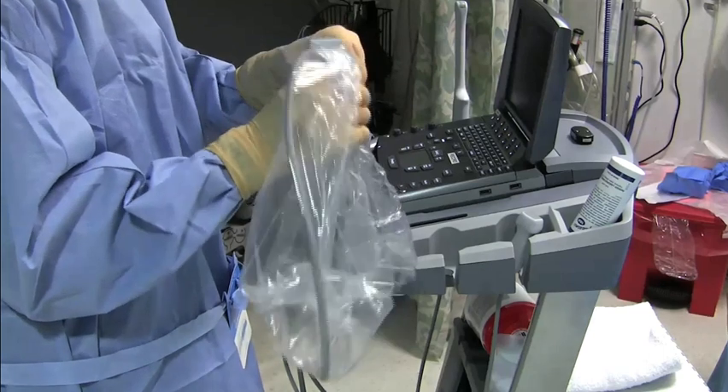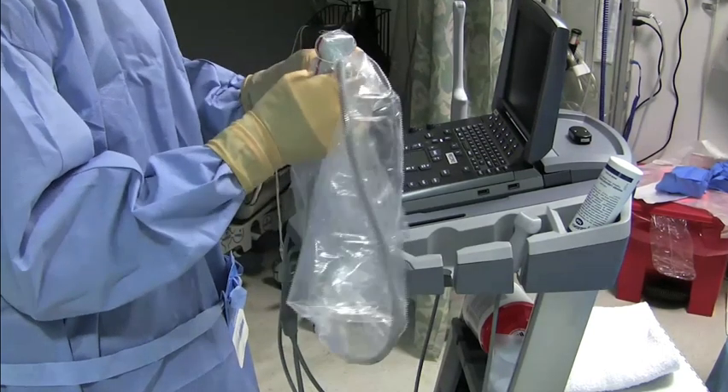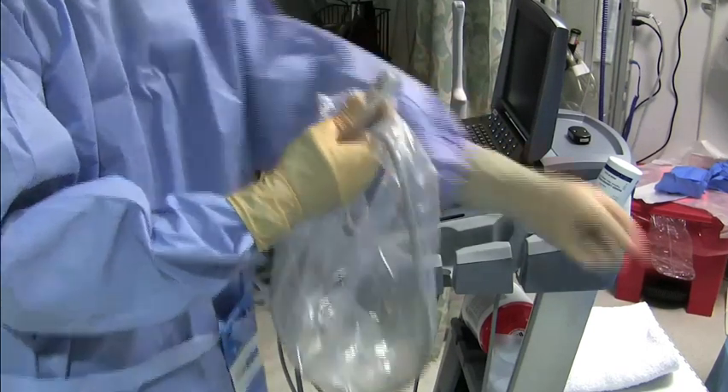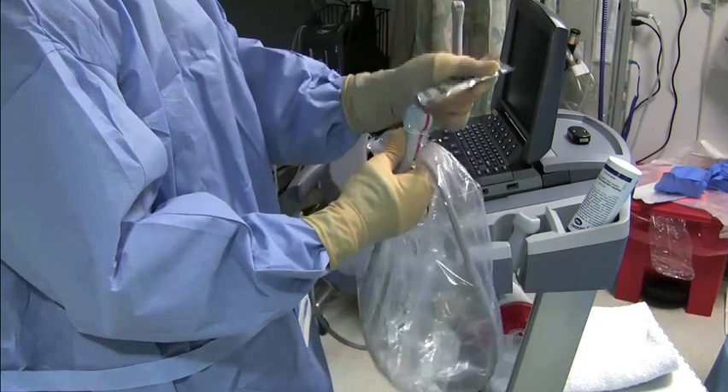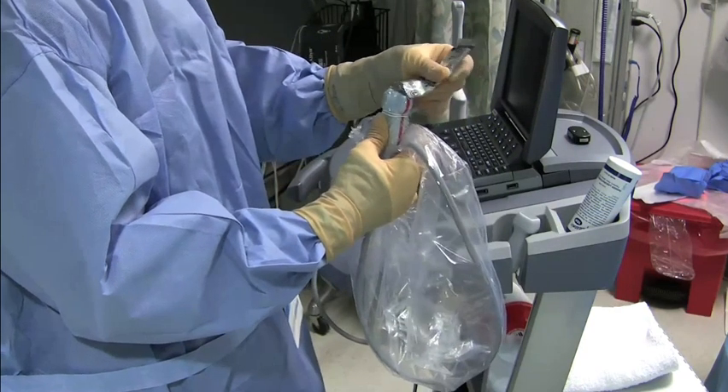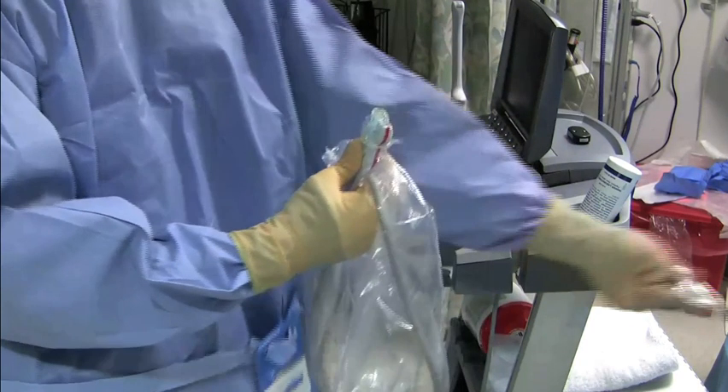This package comes with two rubber bands; you can use either one or two rubber bands to hold the transducer sheath in place. You can now place sterile gel on top of the sheath, and this will allow you to proceed with a continuous layer from the patient through the sterile gel, the transducer sheath, non-sterile gel, and the transducer itself, allowing you to have an ultrasound-guided procedure with full sterile technique.